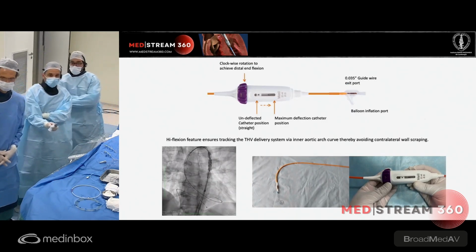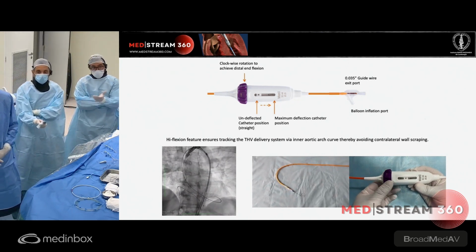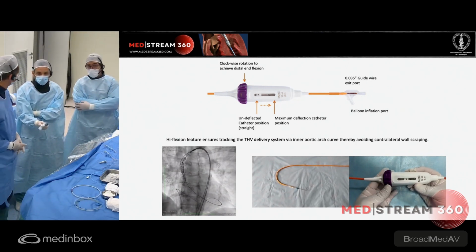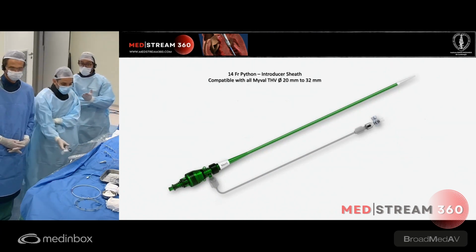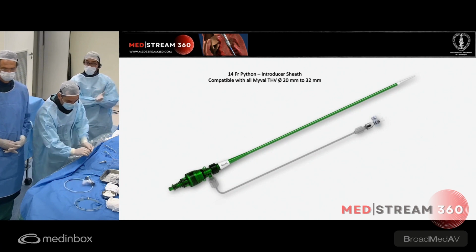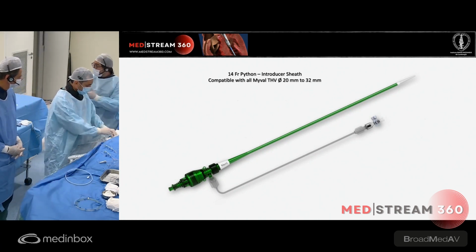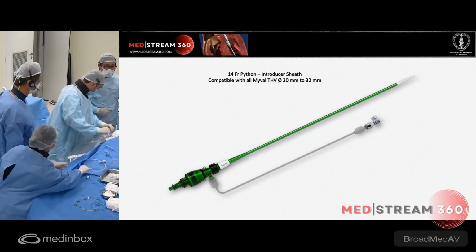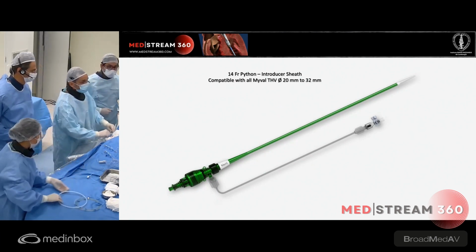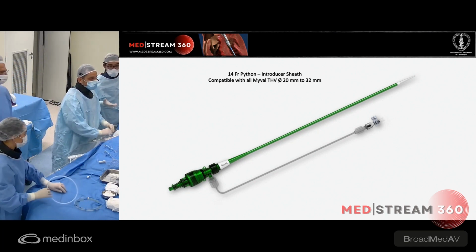The Navigator has a high flexion system and great flexibility. Move on. And the Python one is a 14 French expandable sheath. It is compatible with all the valves from 20 to 32, but from the 27.5, we have to predilate with 18 French. Our experience here is more than 150 cases since December of 2020.